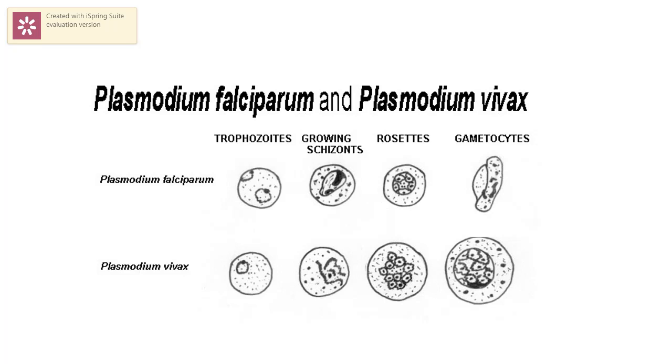In this slide, you can see the morphological differences of different stages of Plasmodium parasites when observed inside the erythrocytes. You can observe morphological differences at the trophozoite stage, at the schizont stage, and at the gametocyte stage. In this way, you can recognize the particular features of a particular parasite, and you will be able to identify and recognize the particular slide which is given to you during examination.